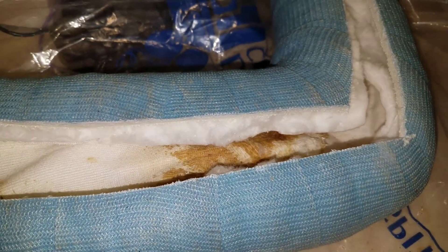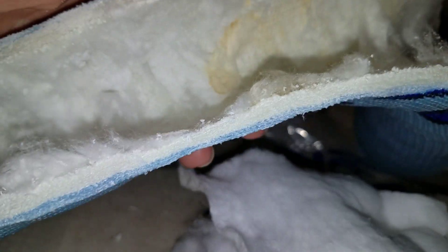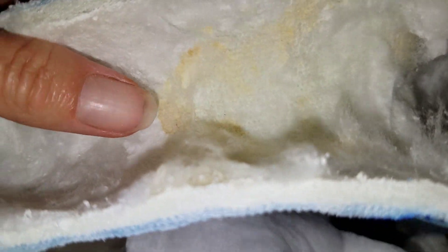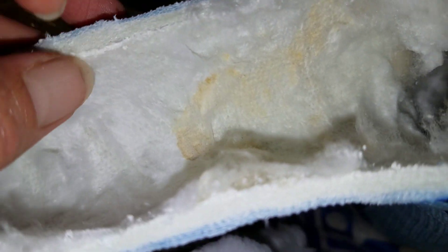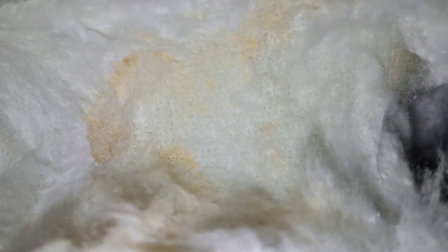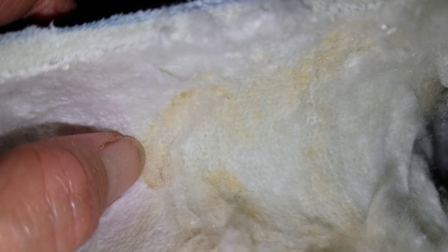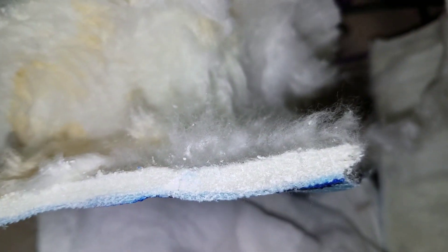So I've torn out some of the inner lining that had the skin fused to it. And you can see it soaked all the way through to the fiberglass. The fiberglass is able to soak back through to her skin, making the reaction worse and worse. This is basically like her skin melting all the way into the fiberglass of the cast. This is all of the cotton batting and the stockinette pulled away — I can touch the fiberglass, you can see the pattern of it. That's how far and how deep it went. It's soaked all the way through.